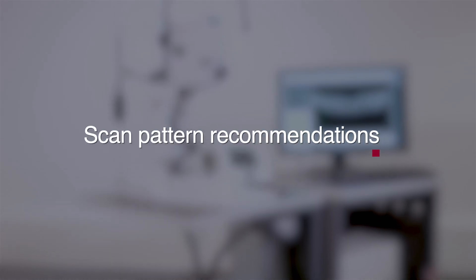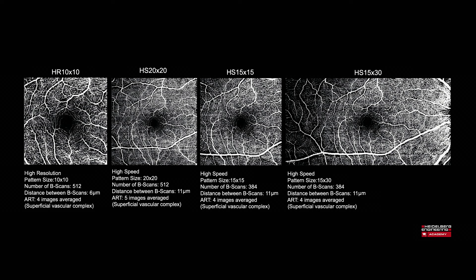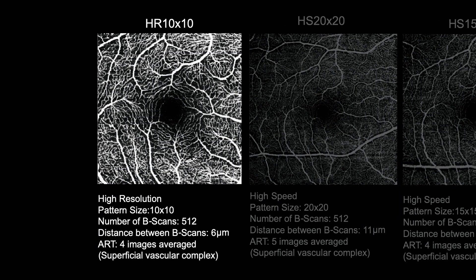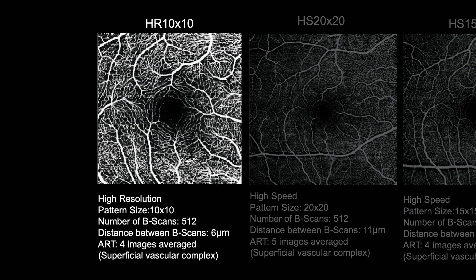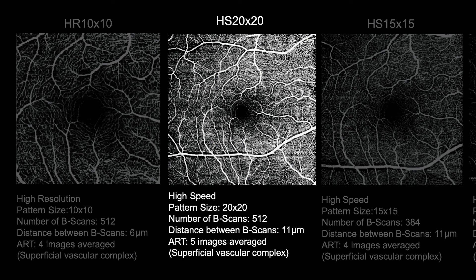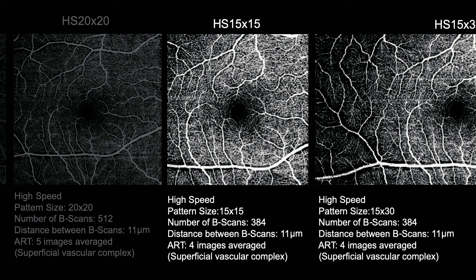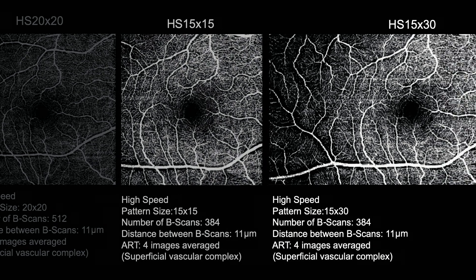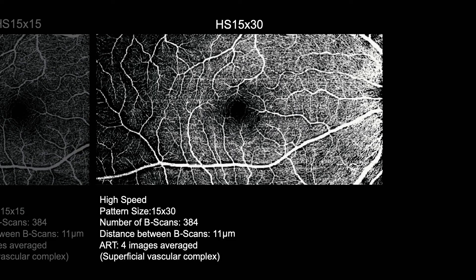Scan pattern recommendations. A number of predefined scan patterns are available on the Spectralis OCTA module. These include a high resolution 10 degree field of view and a high speed 20 degree field of view. Custom scan patterns can be created, and we would recommend including a high speed 15 degree and a high speed 30 degree scan pattern.